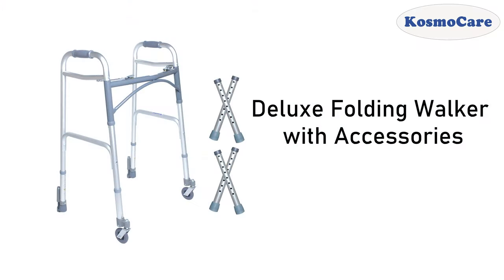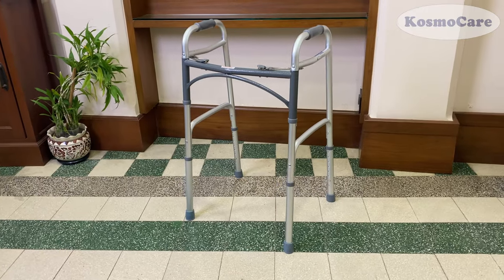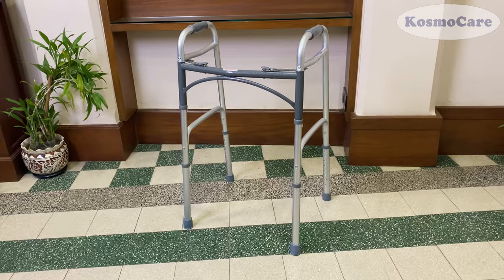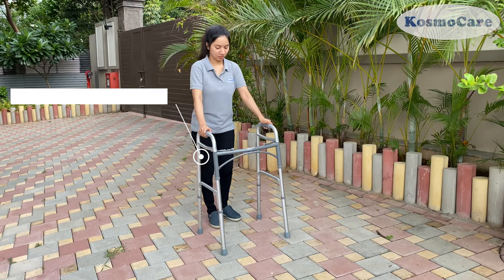Cosmocare Folding Walker offers a stable and reliable helping hand and aid in accommodating a more active lifestyle. The anodized aluminium frame is lightweight yet durable.